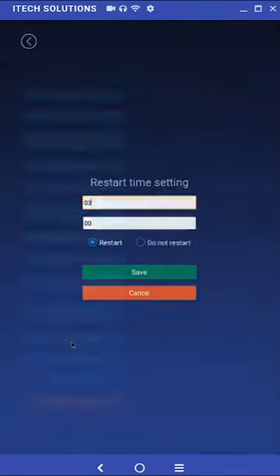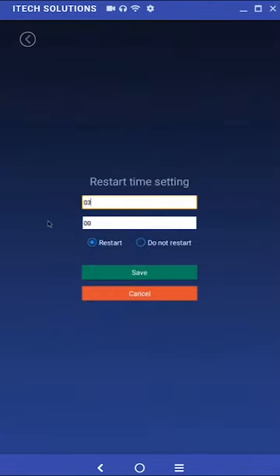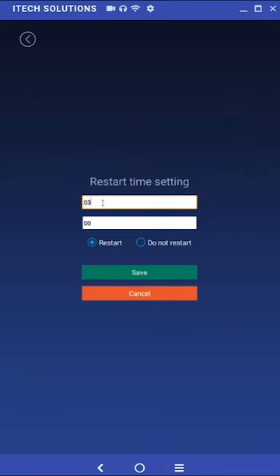Restart time setting. By default the unit is set to automatically restart at 3 am. Simply enter the new time in 24 hour format to set a new restart time. If you wish to disable the unit from restarting you can simply select the do not restart option in this menu.